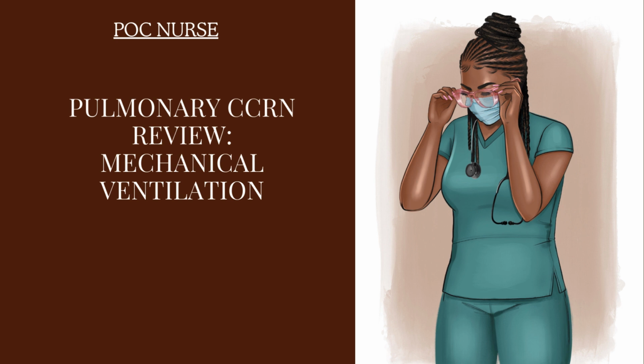For your patients with ARDS, you want to employ lung protective strategies, meaning you want the plateau pressure in the patient's chest to be less than 30 centimeters of water. Now the plateau pressure signifies compliance of the lungs and the chest cavity where air goes in, basically. So if there is decreased compliance, such as the patient with ARDS, you want to push less volume of air into this patient.